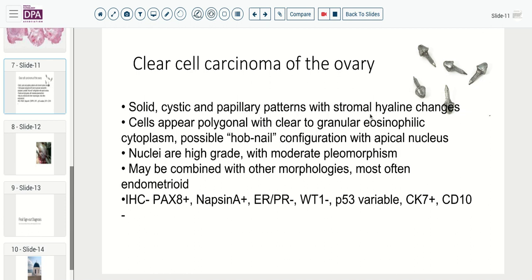In case you haven't seen what a hobnail looks like, this is a nice example of the apical bulbous enlargement with the underlying pointed end that, in the case of the tumors, would be the point of attachment to the underlying stroma. The nuclei tend to be fairly high grade with moderate pleomorphism, and they may be combined with other morphologies, most commonly with endometrioid-type tumors.